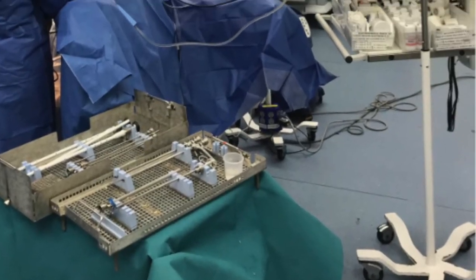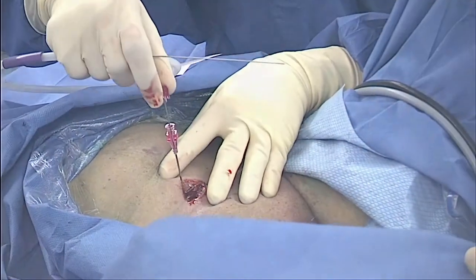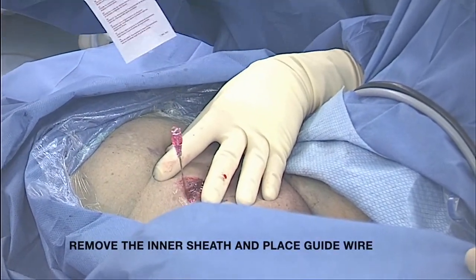Make sure to hang the irrigation at 70 centimeters of water to adequately fill the bladder. The cystoscope has the added benefit of helping occlude wide open urethras to help maintain a full bladder. Note, however, that on blind approaches, this can be achieved with a finger or a Foley catheter balloon. Next, we remove the inner sheath and place the guide wire.